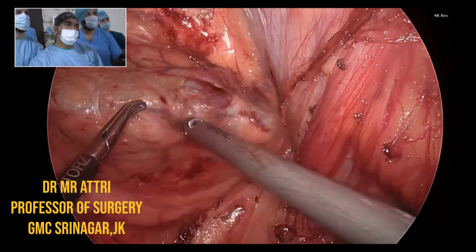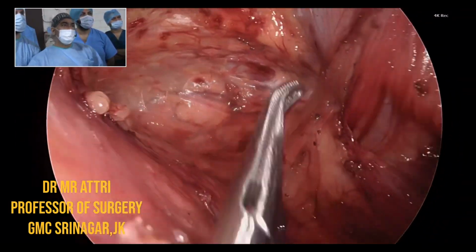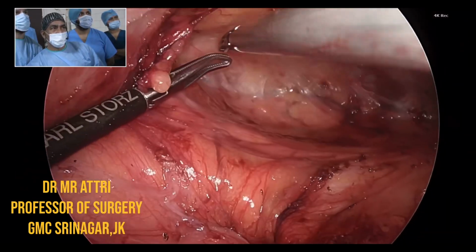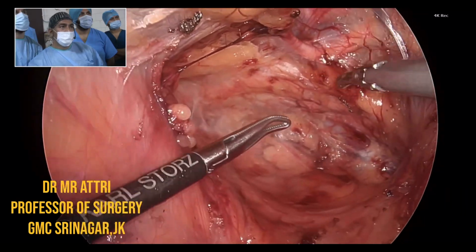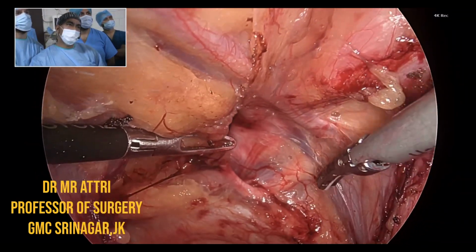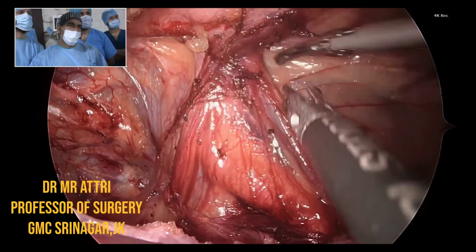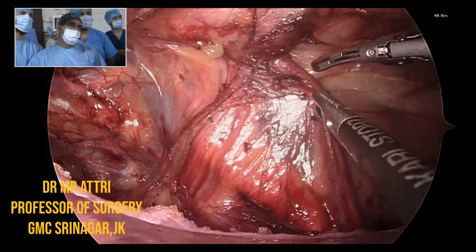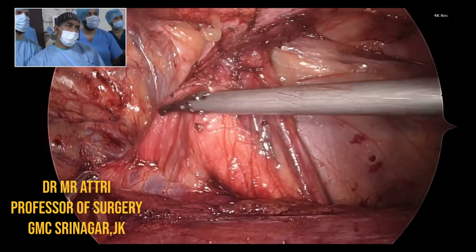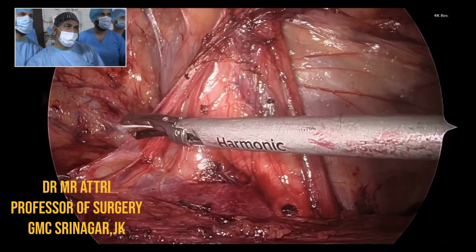And I hope our dissection is almost complete, right? So this is the midline here. We have gone almost 2 centimeters across to the left side. This is the right Cooper's ligament here. This is the direct defect, and this is the internal ring. You see, testicular vessels and spermatic cord are going. This is the spermatic cord, reflected medially. So we have to make sure that no.